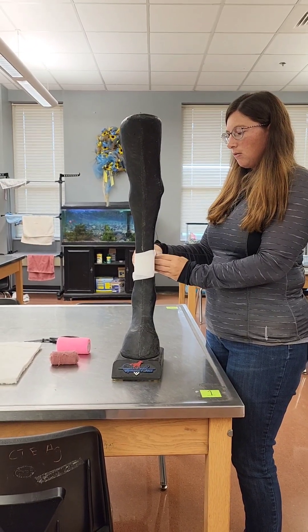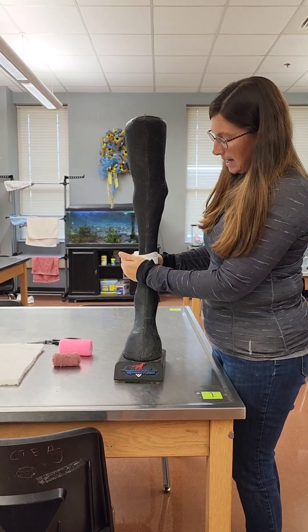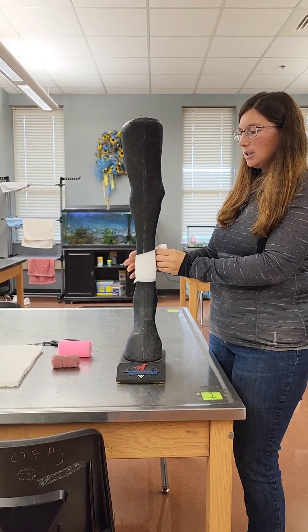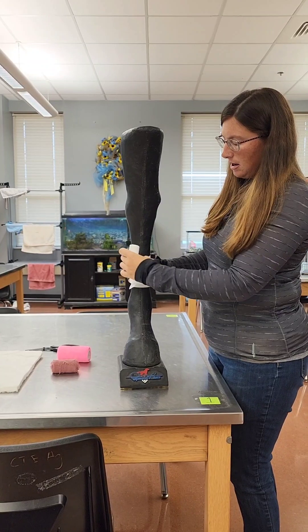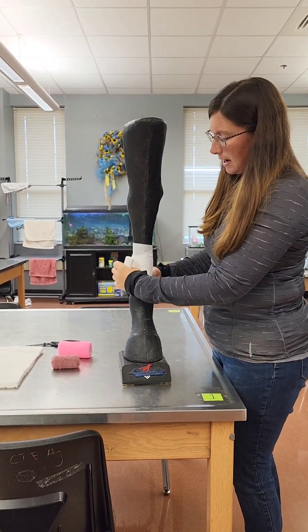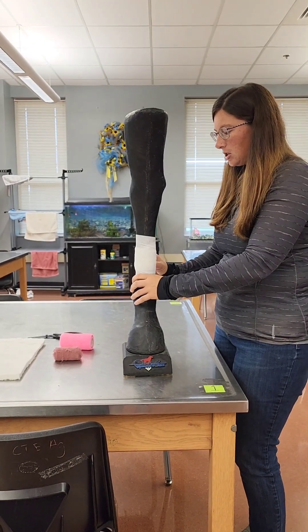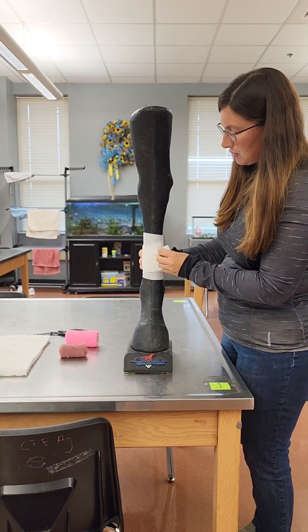You want to wrap your roll gauze so that it is secure but not tight — you do not want to restrict the blood flow to the leg. Make sure as you are wrapping that you are leaving even, flat layers with no wrinkles, and that your dressing underneath does not get wrinkled as well. Any wrinkles will cause pressure on the wound and the leg and can restrict blood flow.